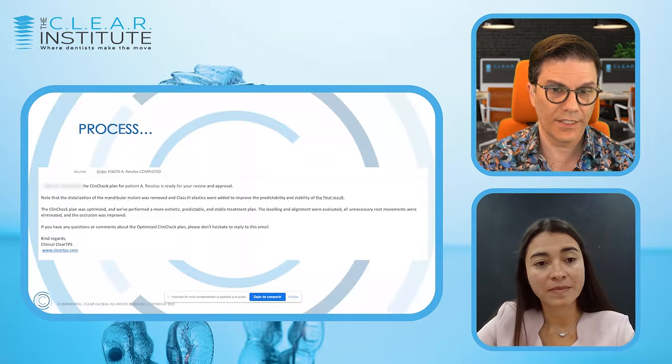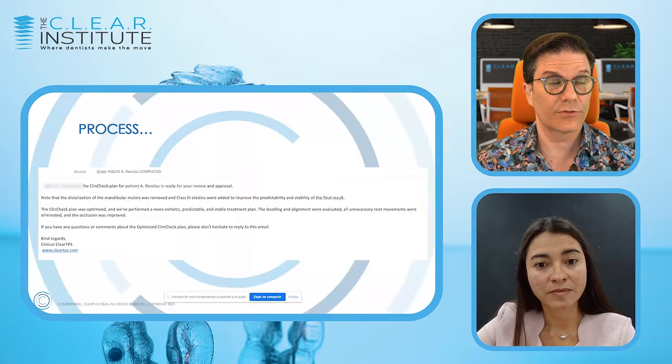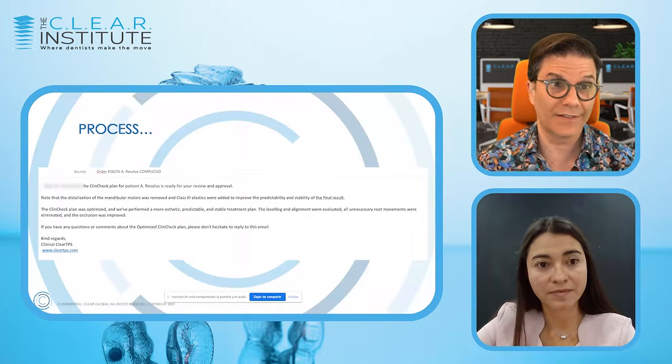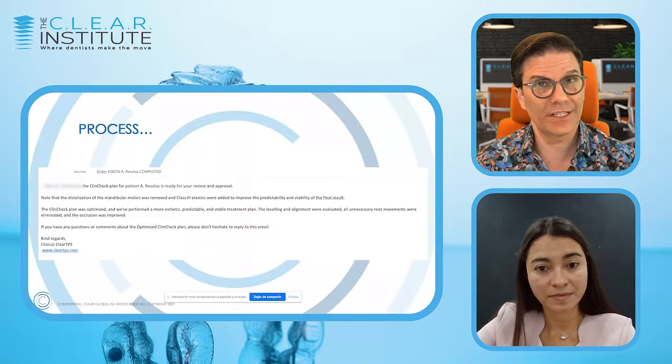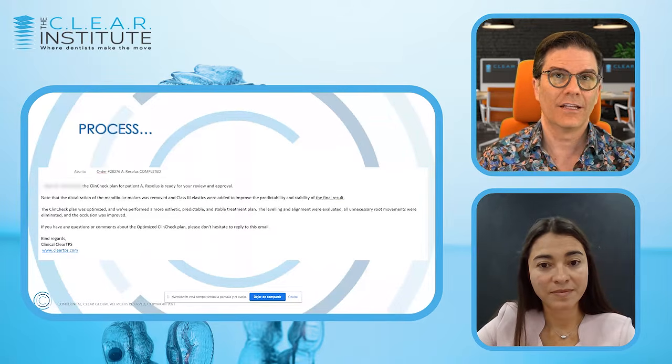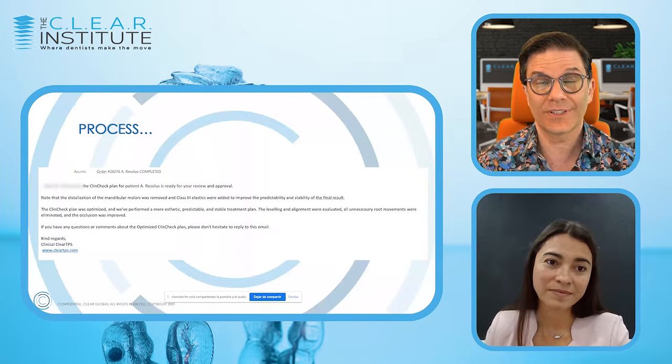Another important thing is that first, you will not accept the case for the doctors, and that's really important. And that's for you doctors to do. I mean, don't think that ClearTPS will accept the case. This is not their job. This is not their responsibility. It is your responsibility to accept the case.